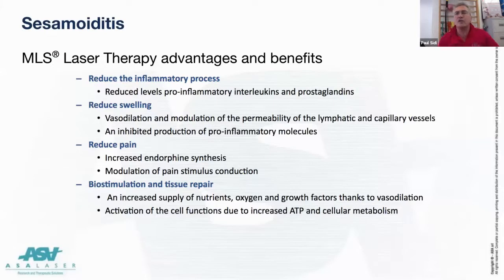It doesn't cook you because it's super pulse, and that 905 is working on inhibition of pain pathways. Now, what we know, and we've always known, is that a pulsed wave will actually help with inhibition of pain pathways. This is super pulse to a nanosecond on, nanosecond off. Tissues heat, cool, heat, cool. So you're sticking in 25 watts, but the maximum temperature you will get there is 42 degrees centigrade. You'll really start feeling some problems at 43 degrees centigrade, and you'll get tissue damage at 45. It can never go there.